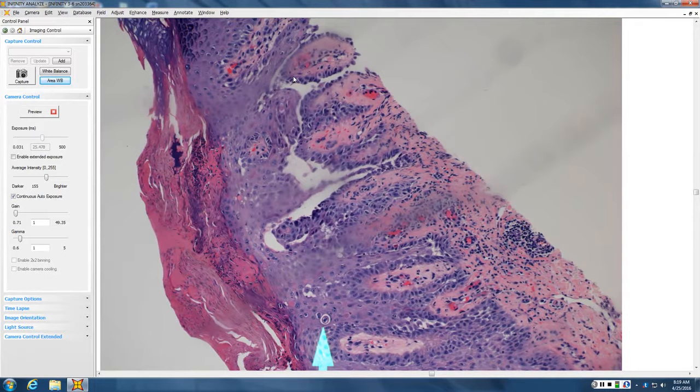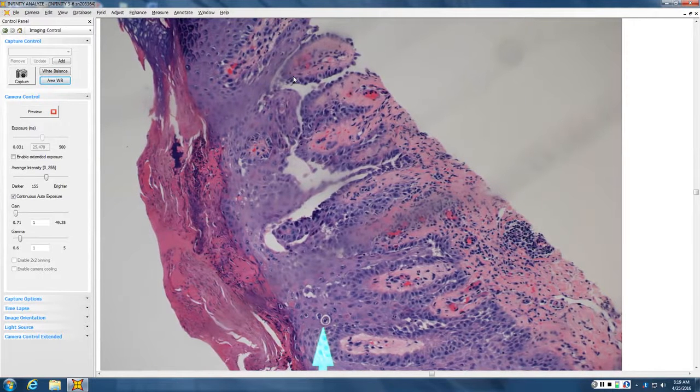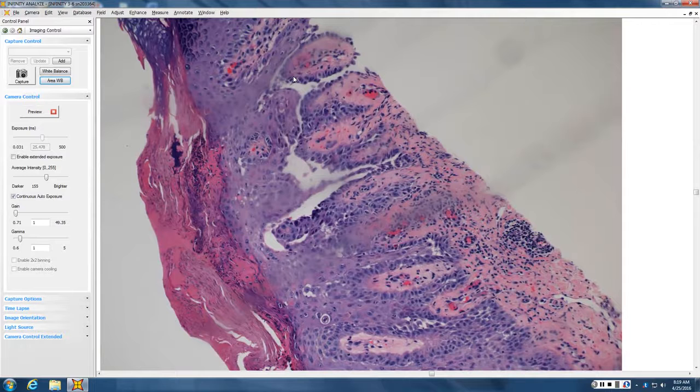There's acantholysis. It's round, and it's surrounded by a clear rim. So it's acantholytic. Is it just acantholytic, or is it also dyskeratotic? So there's acantholytic dyskeratosis, and there is suprabasilar clefting, giving villi. So you've got villi, and you've got corps ronds. So what are you thinking?